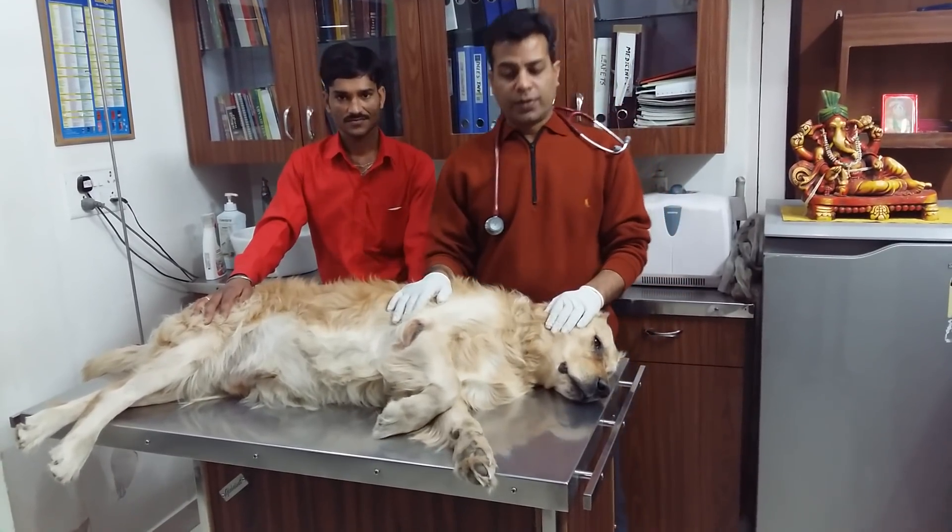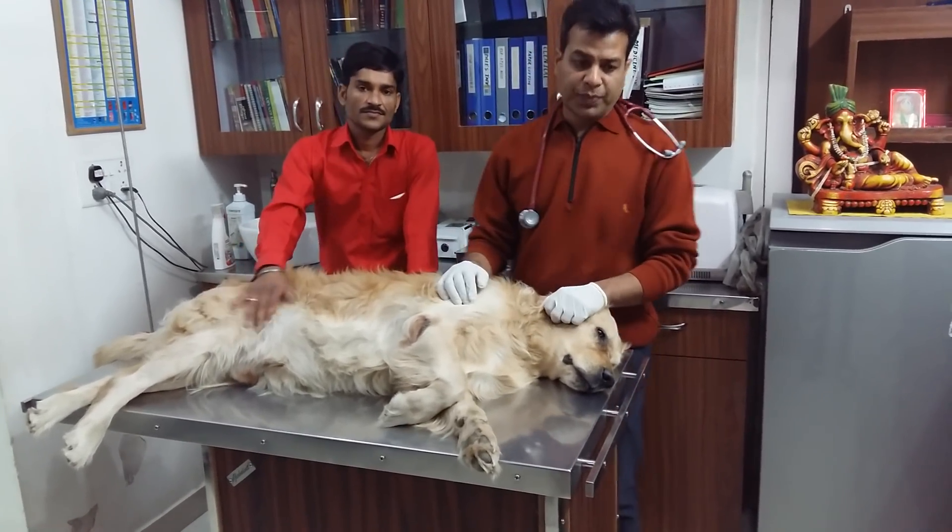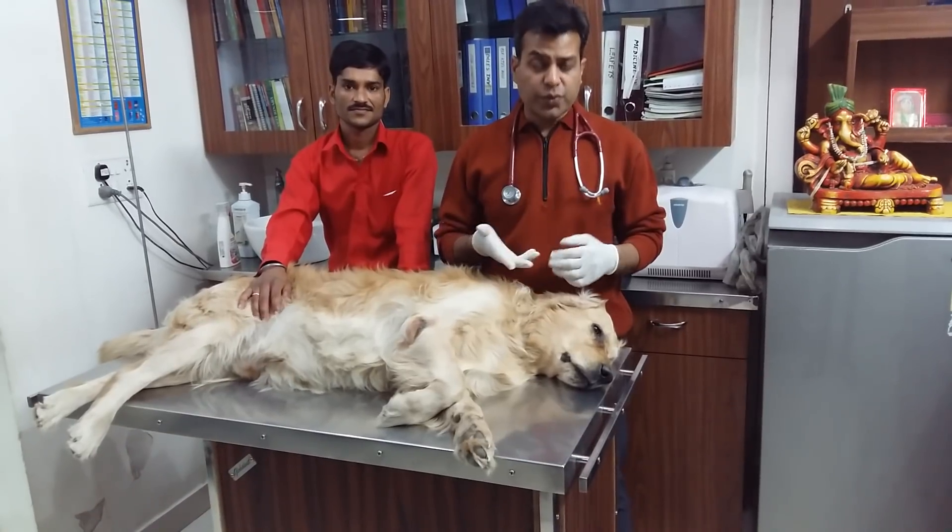Hi, good evening. This is Dr. Mukesh Tiwari. Today, I will introduce you to how to flush the nasolacrimal duct using a small cannula.